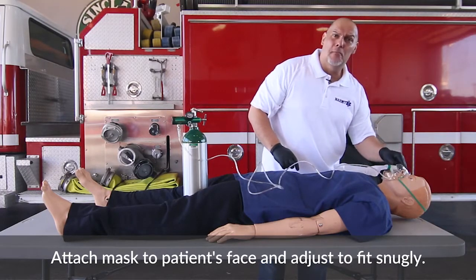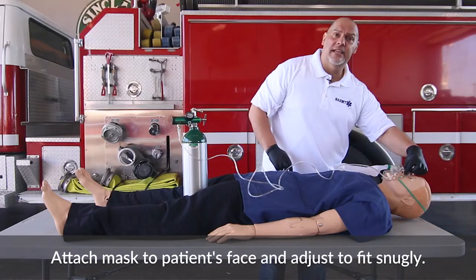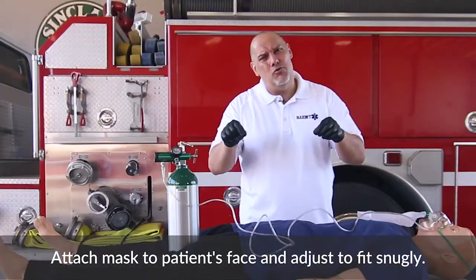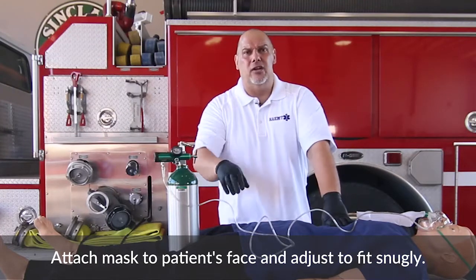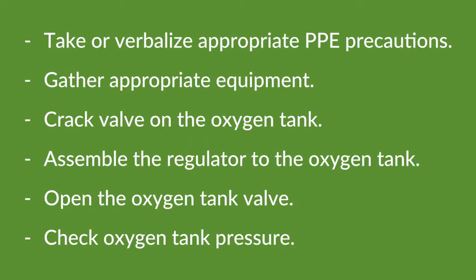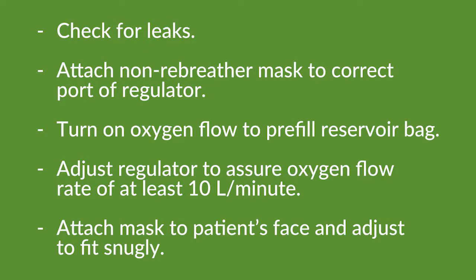You'll notice there's a little metal band on the mask — pinch that around the nose to create a seal. Don't crimp it down too tight as it will be uncomfortable for the patient, but this is how you complete oxygen administration via non-rebreather.